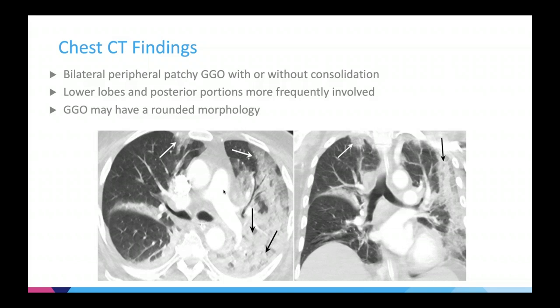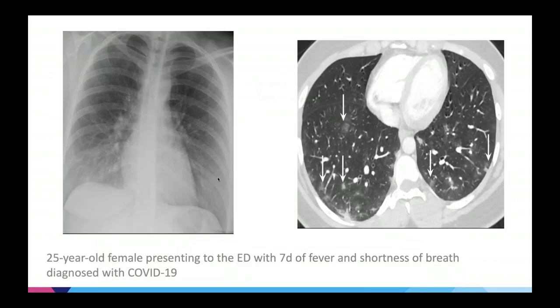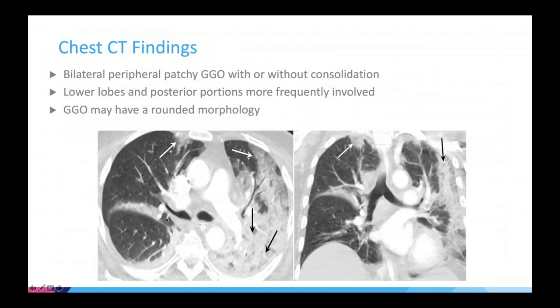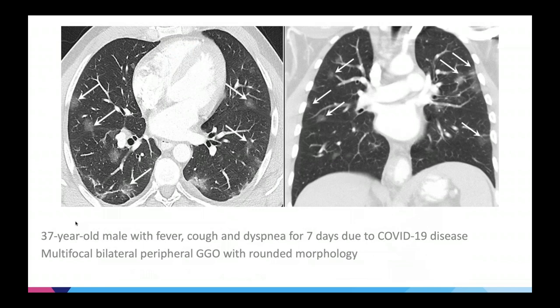Additional findings described on chest CT include the crazy paving pattern, which involves interlobular septal thickening. Here is an example of a 60-year-old male with fever and symptoms for seven days, showing round ground glass opacity with reticulation in the peripheral areas of the lung — typical for what we call a crazy paving pattern, which is also highly suspicious for COVID-19 infection.